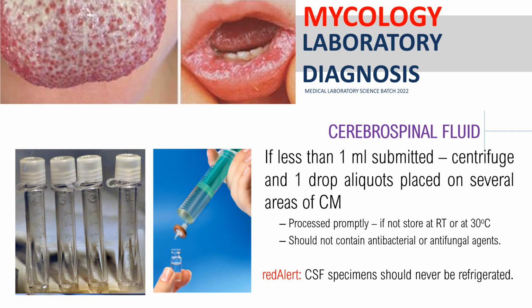But samples that are considered sterile, pwede na tayong hindi mag-add ng antibacterial class, kasi pwede nang double yung identification. Kasi pag sinabing sterile, like for example blood and CSF, ibig sabihin nun class, dapat wala talagang organism. Okay class, pakitandaan na lang din, CSF specimen should never be refrigerated.